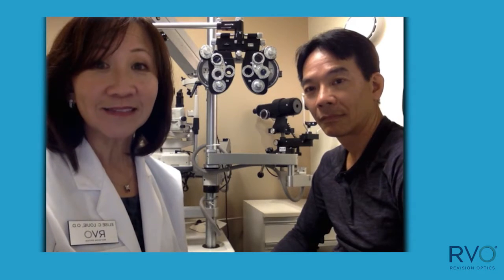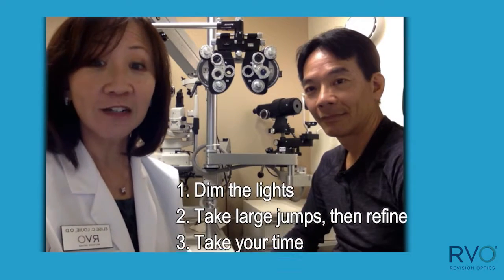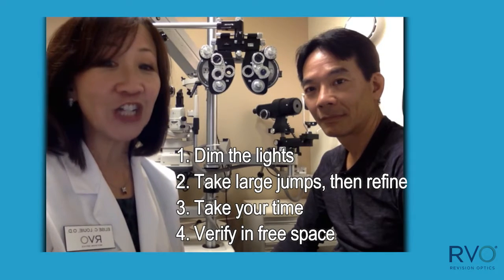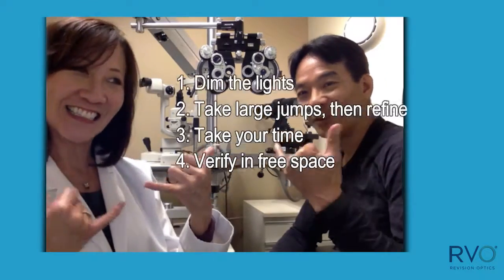In summary: dim the lights, take large jumps, and then refine as you go along. Take your time and verify in free space. This is a good method for measuring the refraction of a patient with a raindrop corneal inlay. Aloha.